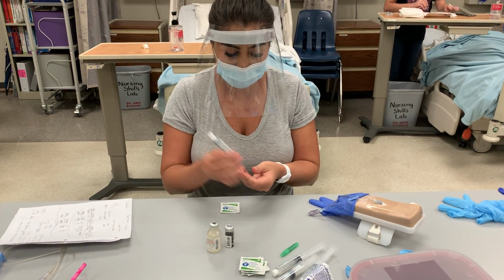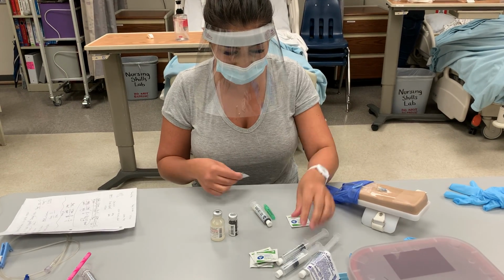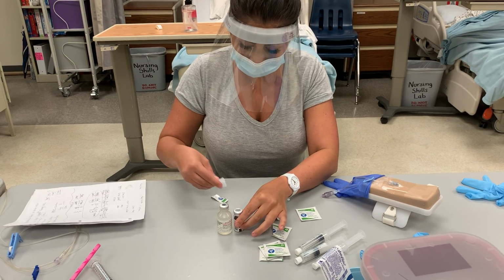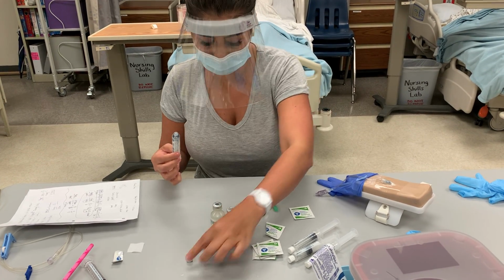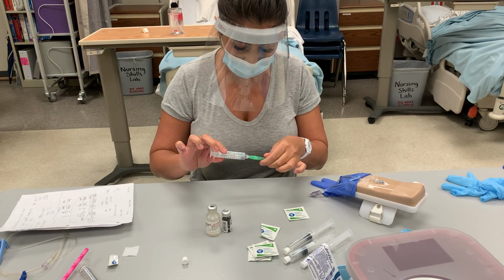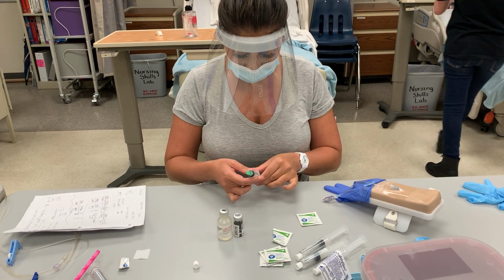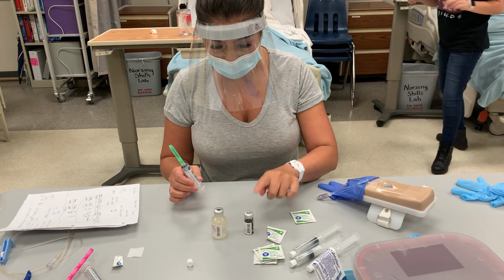So I have a 10 mL syringe and my 18 gauge needle. I have my alcohol. I'm going to go ahead and clean these. This would be in a package and it would be all aseptic. I'm going to go ahead and connect that. And then I'm going to put air in my saline first and then in my medication.